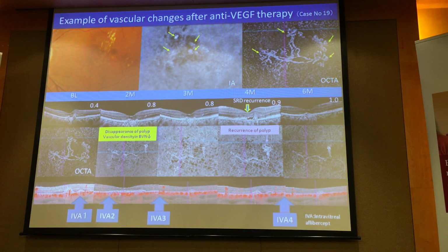Dr. Takahashi, very nice presentation. Thank you. I had a question about the regression rate of polyps where there was a significant vascular component, high flow versus low flow. In some of the low flow images, you showed us that there are some occluded vessels. Do you think that the occlusion of those vessels reflects a difference in the evolution of those polyps, that they may be thrombosed, and therefore have less VEGF expression and a reduced VEGF response?